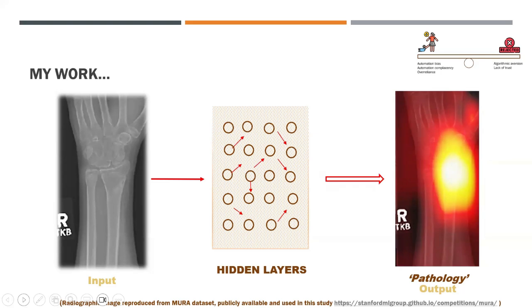So I'm just going to use two studies as an example of what I'm talking about today. The first study I'll talk about is using images, or well, both studies actually. The neural network that we used was trained on the MURA data set of upper musculoskeletal images for training a convolutional neural network. We then put a Grad-CAM layer onto that as well to get this heat map type format. And we also had a text output, pathology, no pathology, in binary format, and the percentage confidence of the AI in the decision.